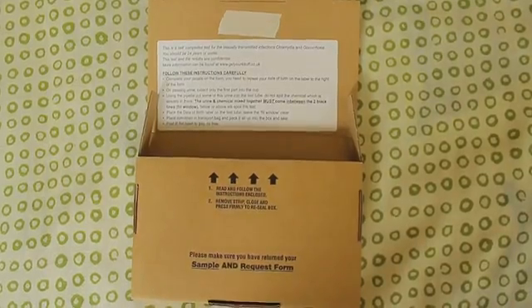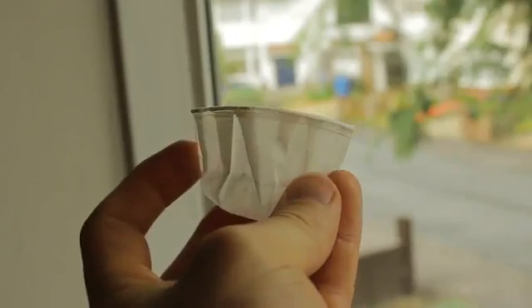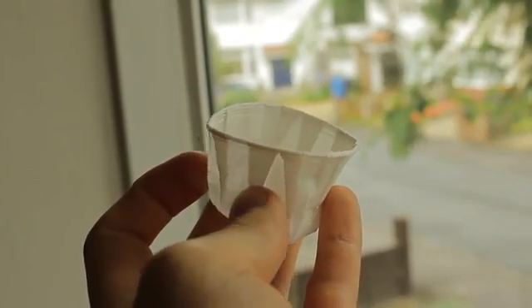You'll need the box for instructions and to send off your test. This cup, or paper shot glass, is to collect your sample. This is the pipette and the test tube that you'll eventually put your sample into. This is the form with which you'll need to fill in your details. This is the bag that you'll put your sample into. But first things first, we need a sample.